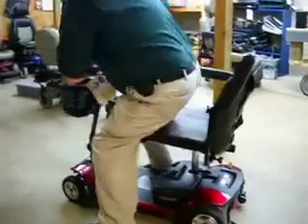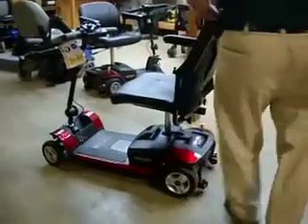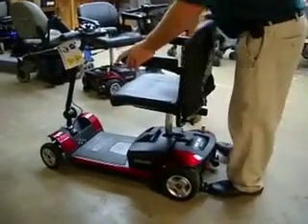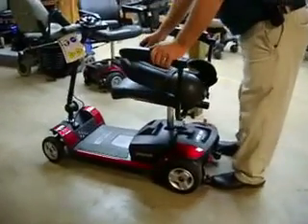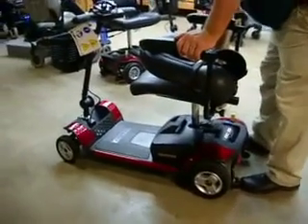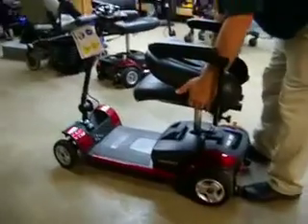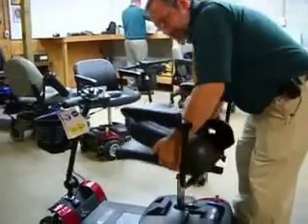This is Rodney McCarthy, ATP with ProTech Medical. We're going to be demonstrating today Pride Mobility's Go-Go Elite Traveler. The model we're showing today is a four-wheel model scooter, and it is covered by Medicare. And this is Bobby with ProTech Medical.